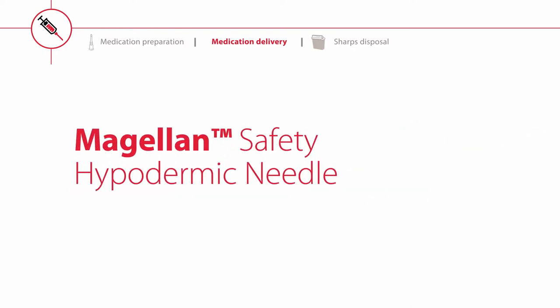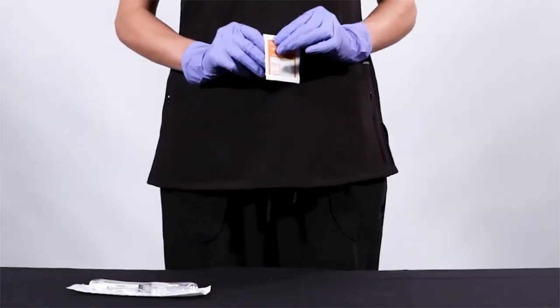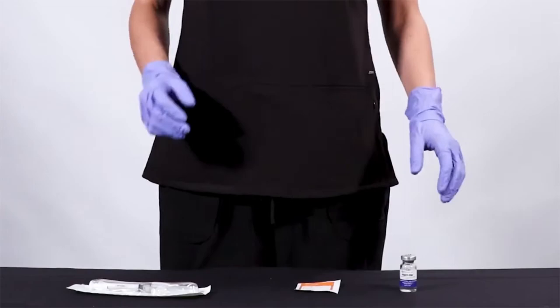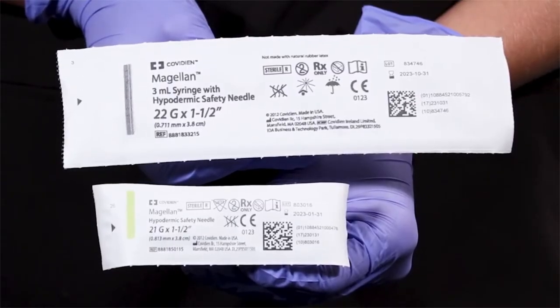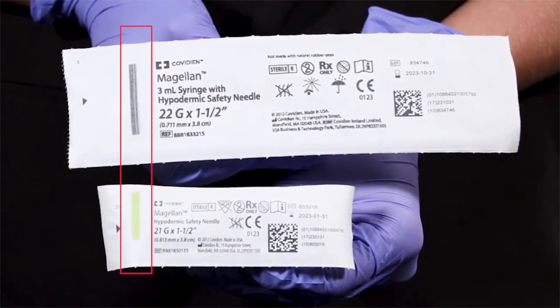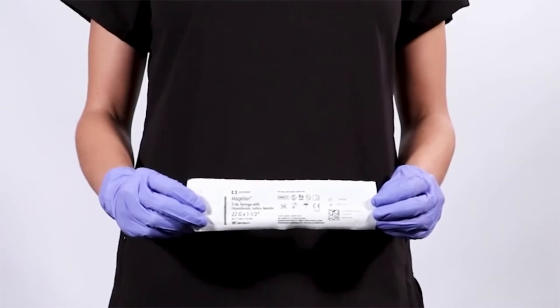The following section will cover the use of the Magellan safety hypodermic needle. Begin by gathering all the necessary supplies for your procedure according to your facility's protocol. To open your Magellan safety hypodermic needle, locate the ISO color-coded stripe on the back of the package. This will identify our convenient peel tabs.